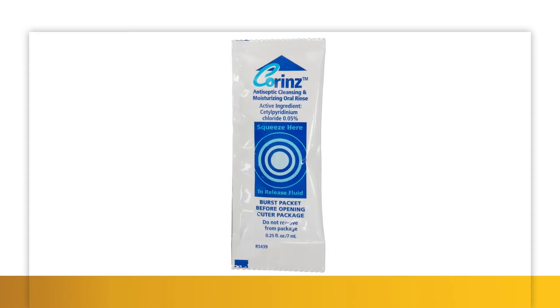Our CoRINs Oral Rinse is an antiseptic cleansing solution that helps reduce bacteria in the mouth. The solution cleans and moisturizes with a pleasant spearmint flavor.